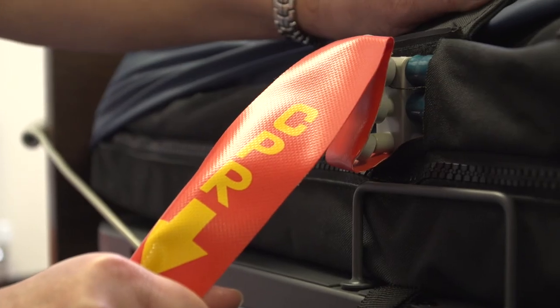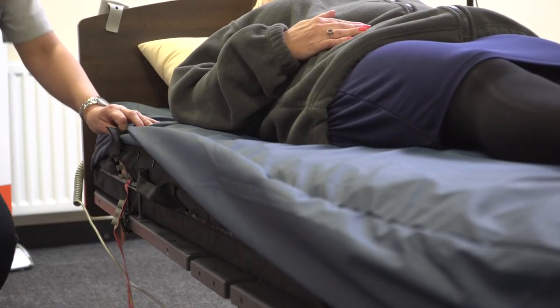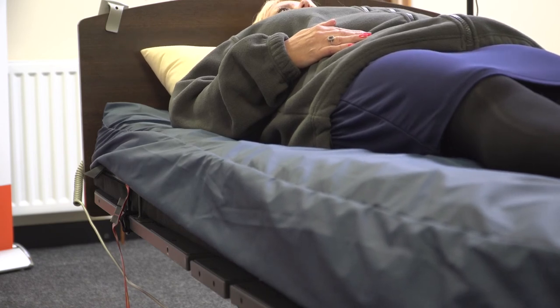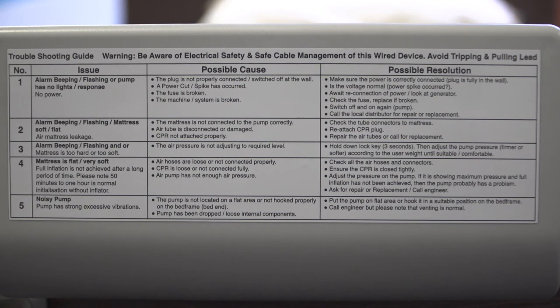A simple check can be conducted by placing the hand underneath the sacral area in the region of the deflated cell. If CPR needs to be administered, the red tag labelled CPR is located behind the third cell and a swift pull is required to achieve deflation. The system will deflate rapidly in a matter of seconds. CPR can then commence.